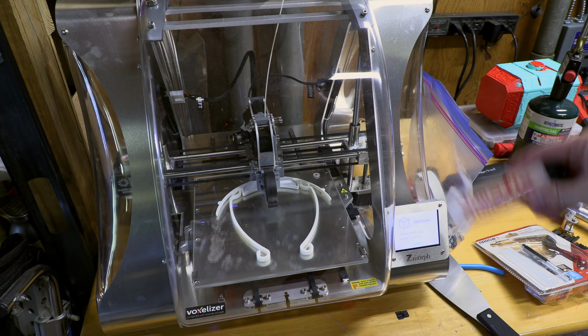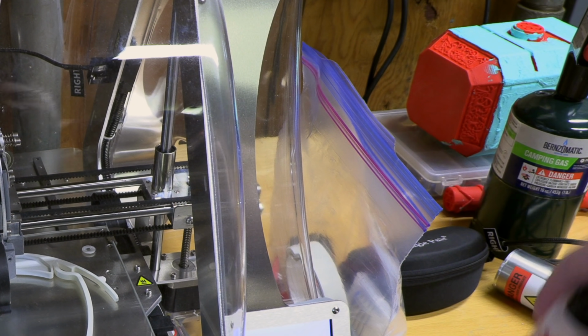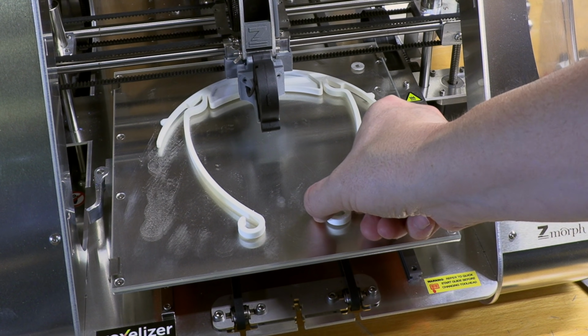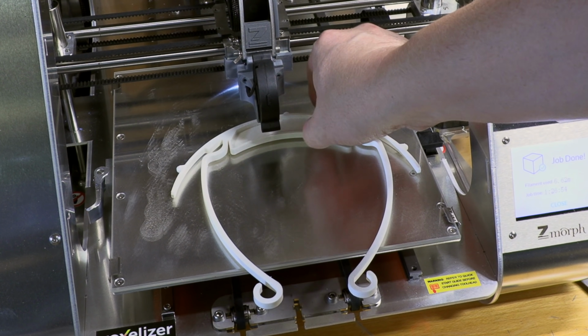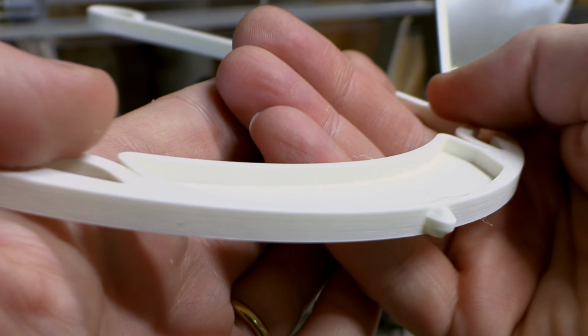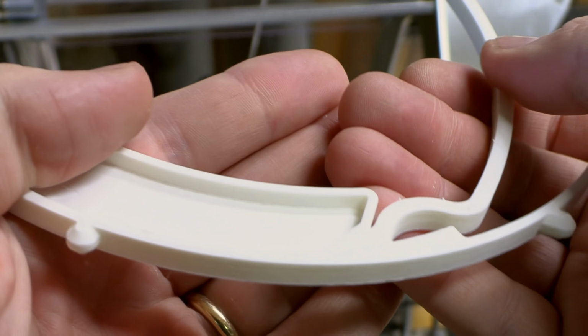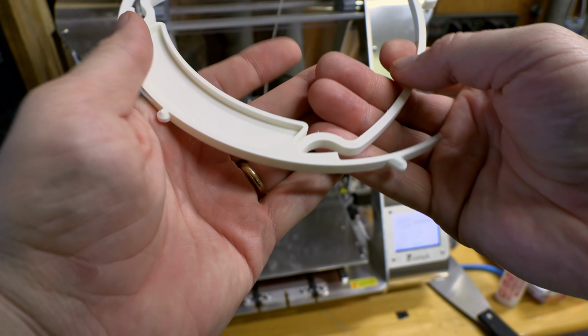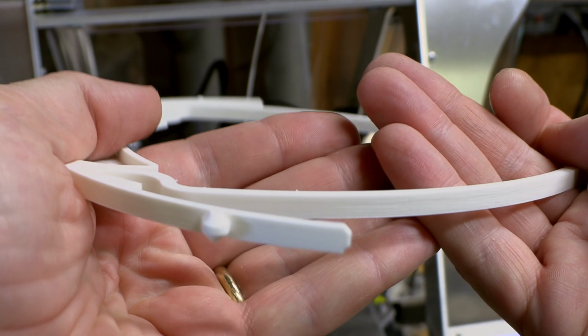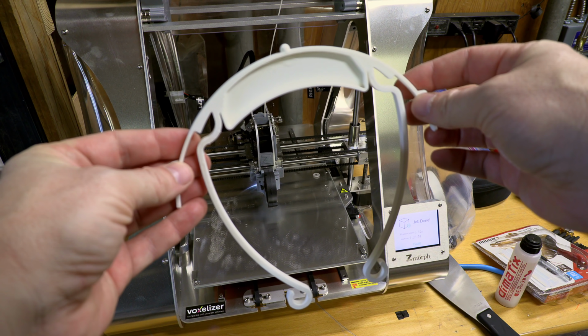Here's the Zmorph. It's got that Dima fix on the glass build plate. So we pop this up, magnets hold it in place, and then it should just, love it when it does that. This is using Zmorph PLA, and that's a darn decent model right there. Extrusions look pretty great. I know white isn't the easiest thing to see on camera, but that looks pretty darn good. Well, this is usable. On to the next machine.